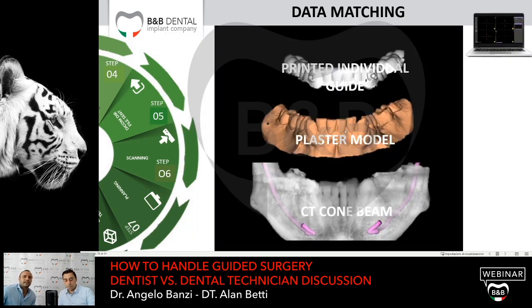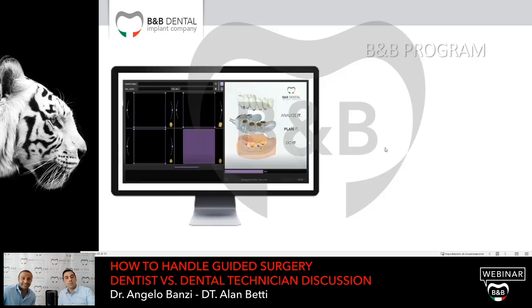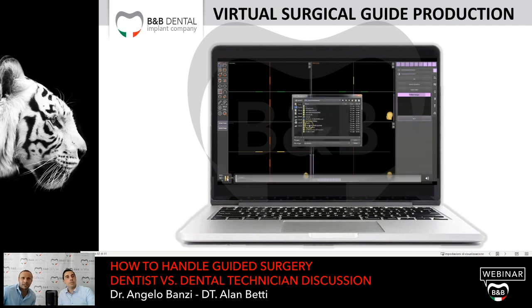So in this case, the matching is going to be done. It should be this one, but it's not, because as mentioned before, he decided to match the case without using the radiological template, but just teeth, because I've got a lot of teeth.